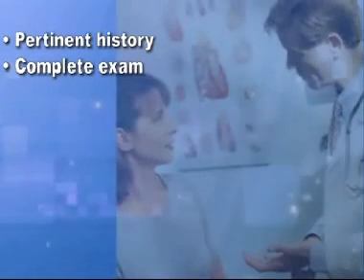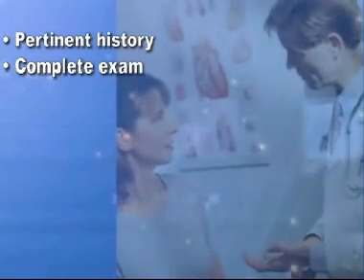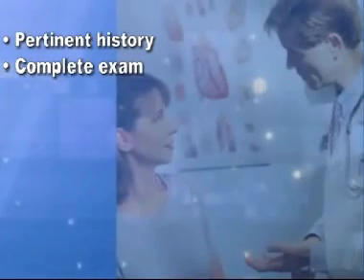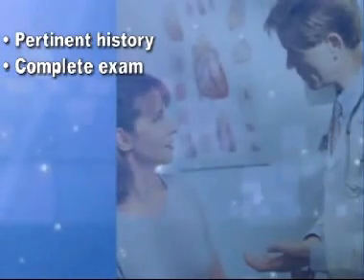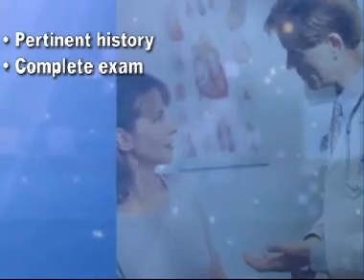The patient should be dressed to accommodate comparison imaging. Comparison imaging is not routine in the shoulder and is accomplished only on a case-by-case basis.